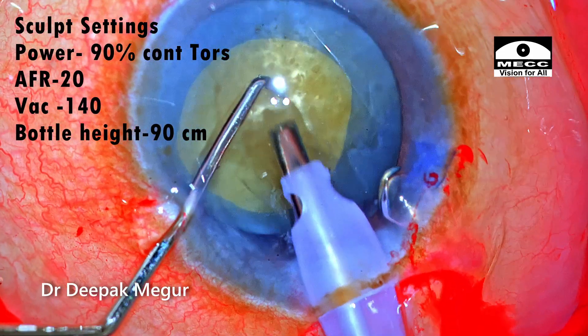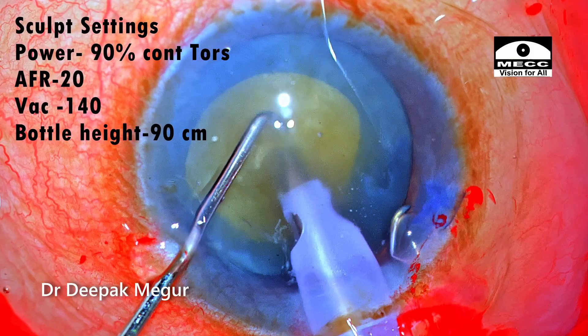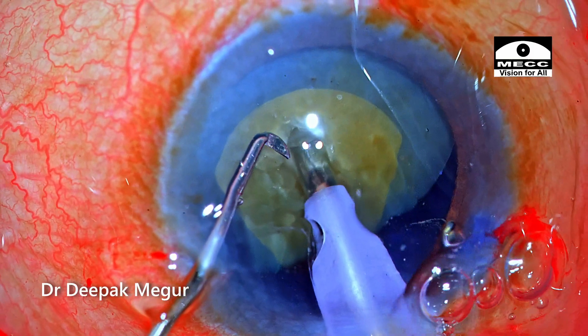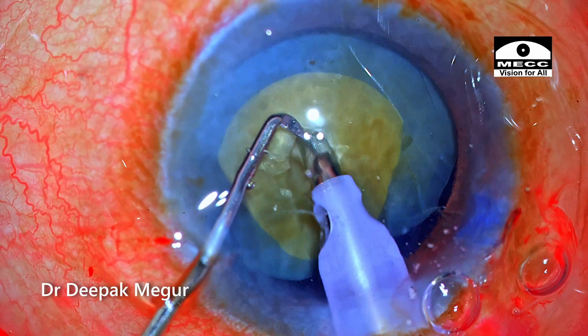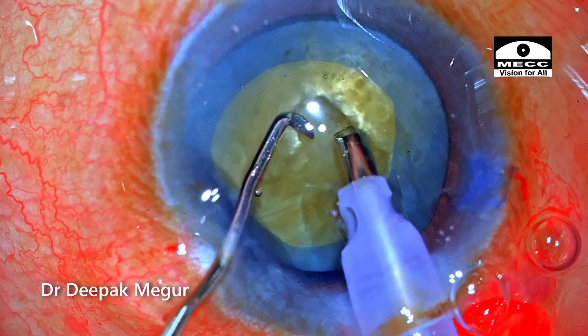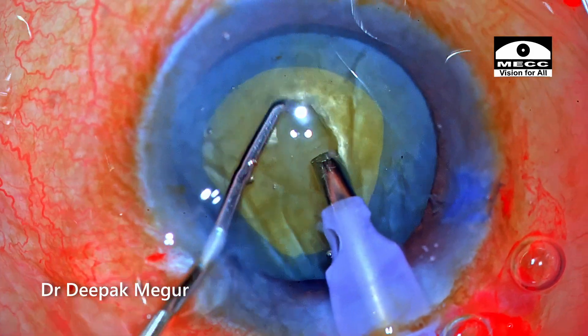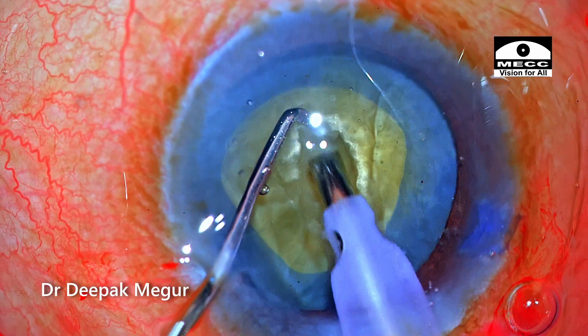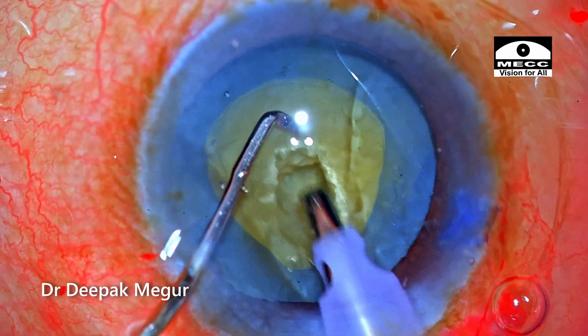I begin my nucleus management by initially sculpting, which is my usual technique, so that I can hold the core of the nucleus before starting to chop. Once I've reached around 50 to 60 percent depth of the nucleus, I've decided to perform the direct chop — specifically the horizontal chop technique.